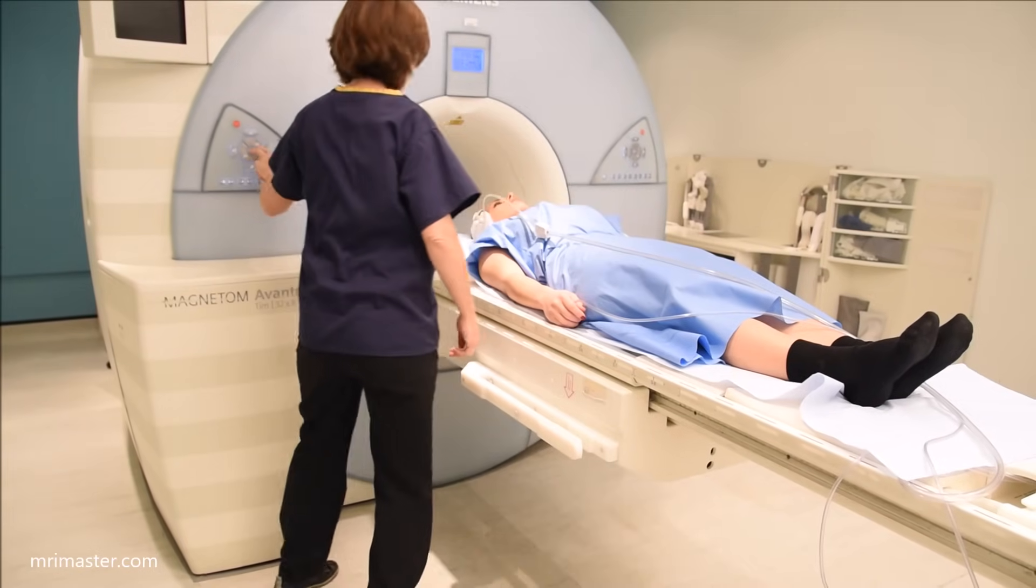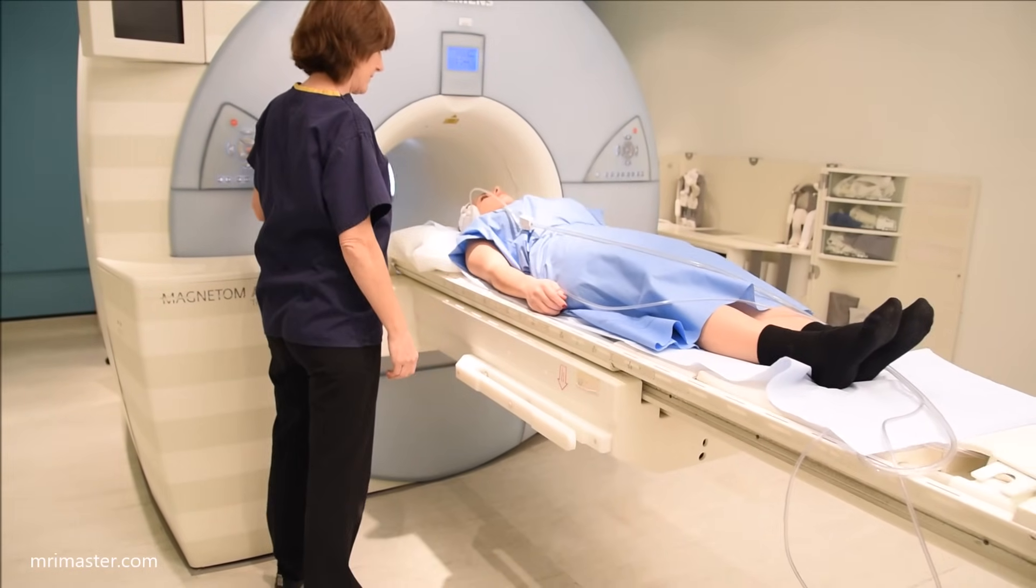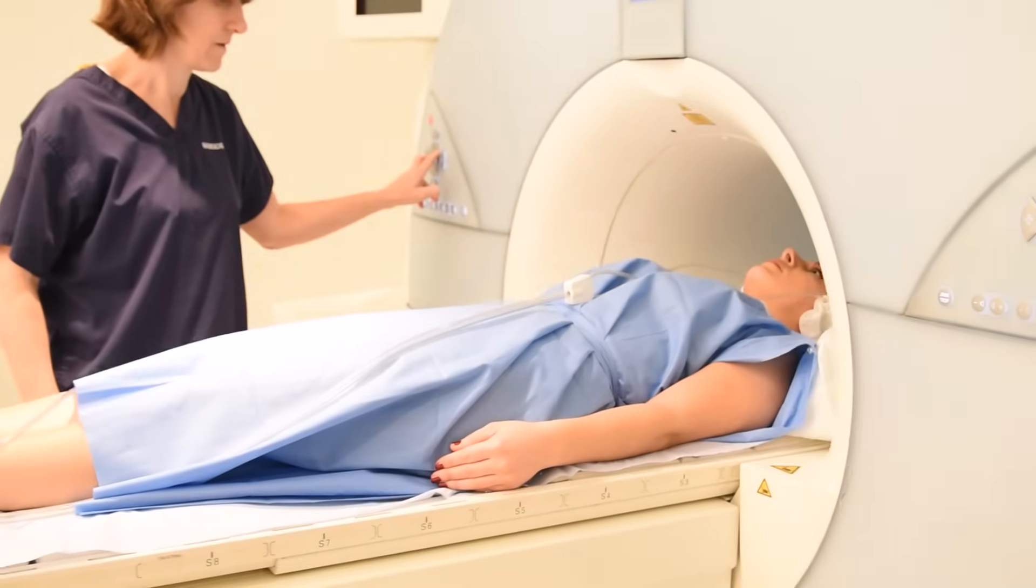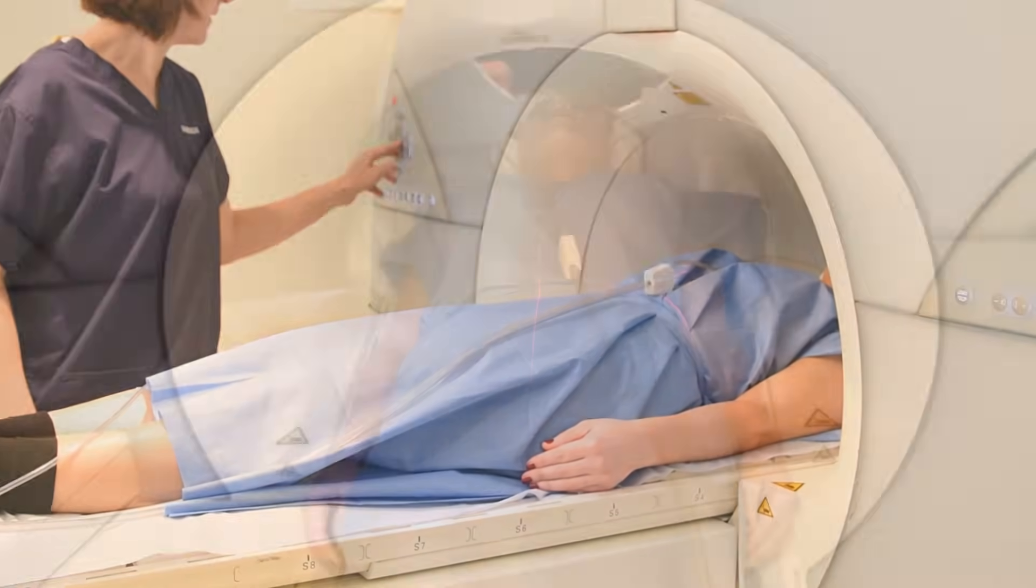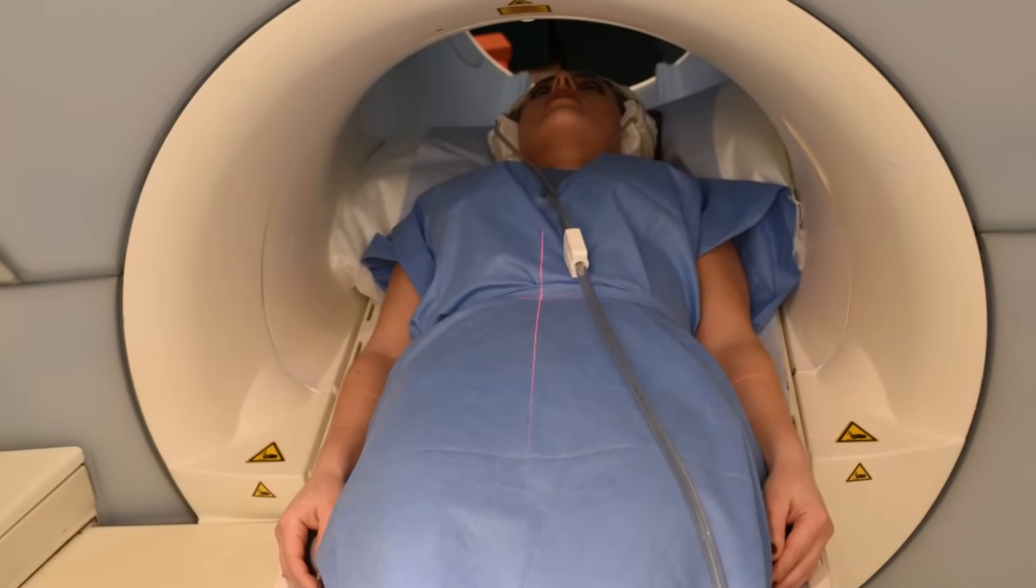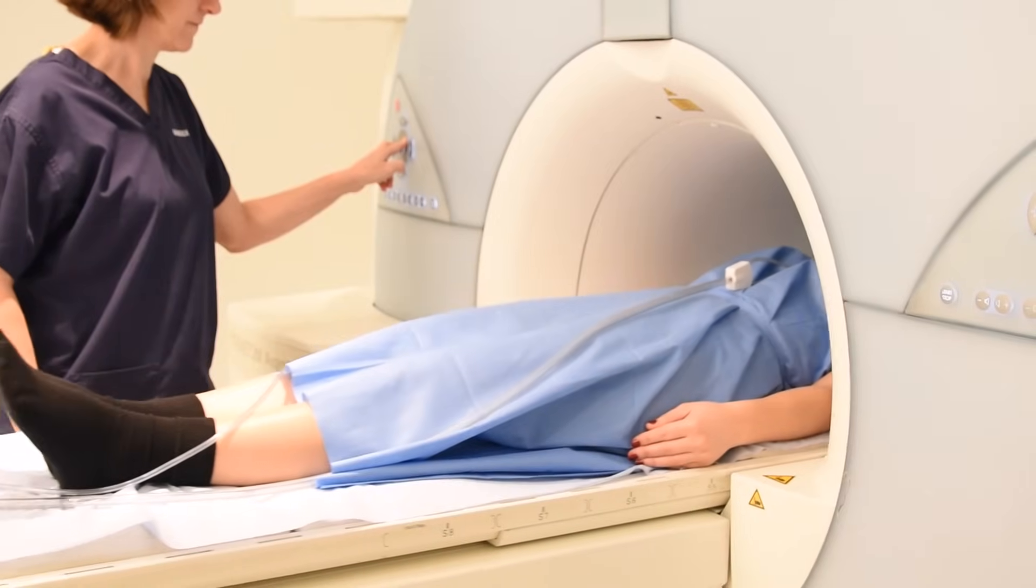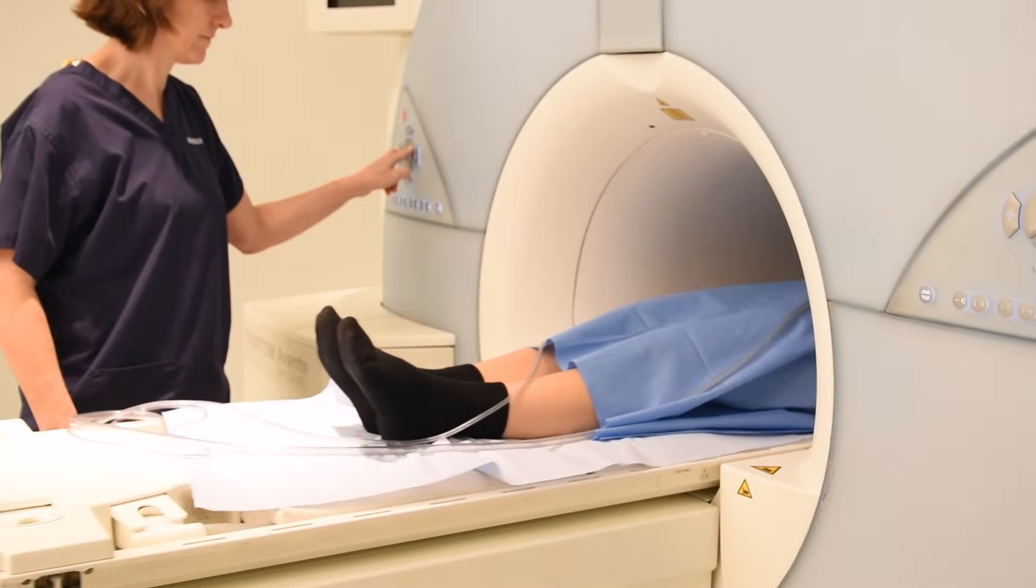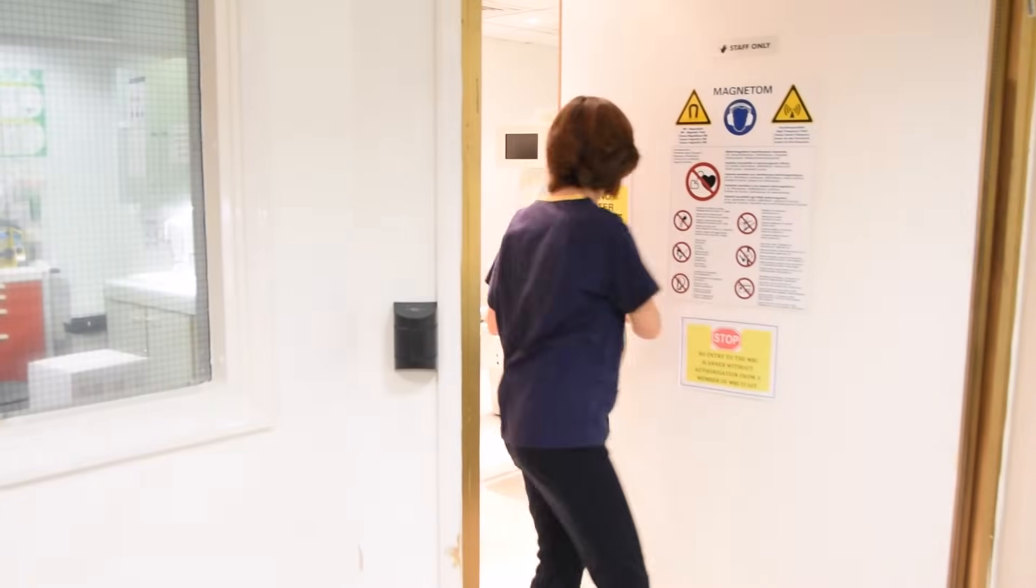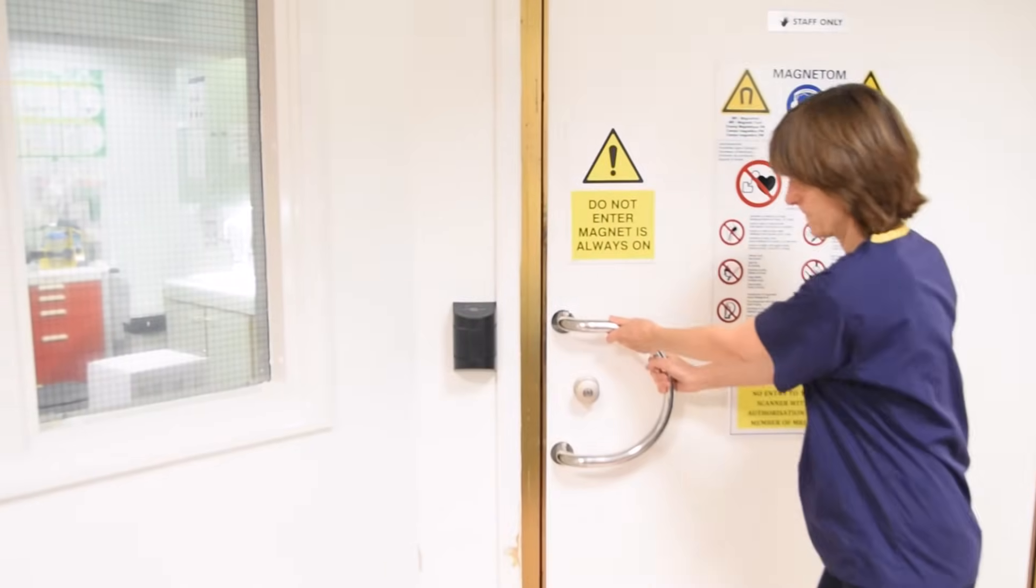Carefully move the patient into the scanner and center four inches above the iliac crest. Now move the patient fully into the bore of the magnet. Ensure that the patient is calm and comfortable before leaving the room.